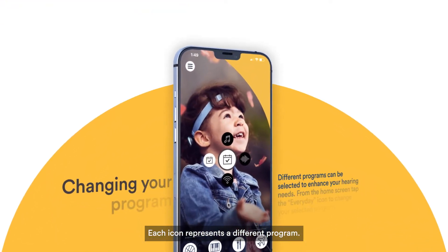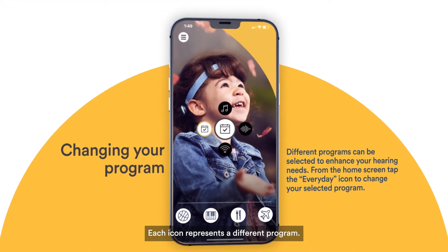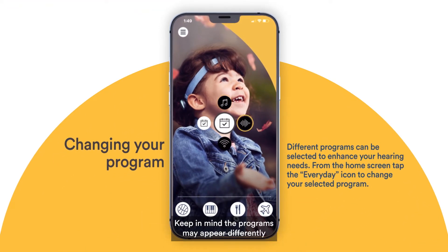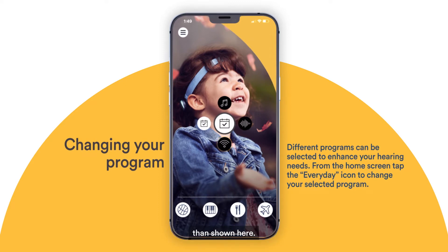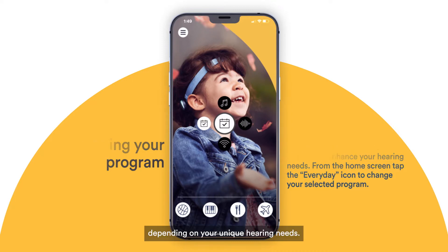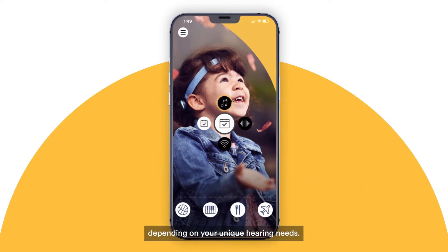Each icon represents a different program. Keep in mind the programs may appear differently than shown here. Your audiologist may have configured this differently depending on your unique hearing needs.